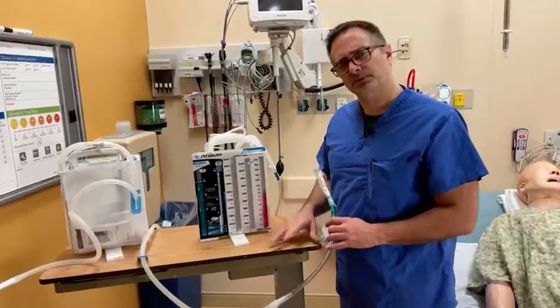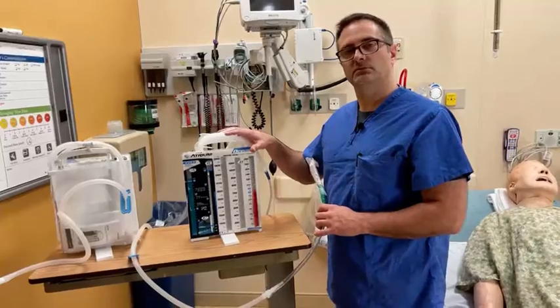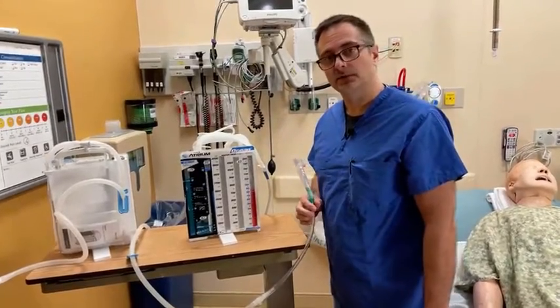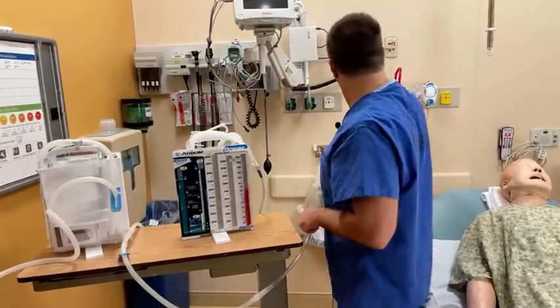For demonstration purposes, I'm going to leave it on the table for right now, but we always want to keep the chest drainage system usually below the level of our patient. But just to demonstrate, I'm going to hook this up and turn on our suction.